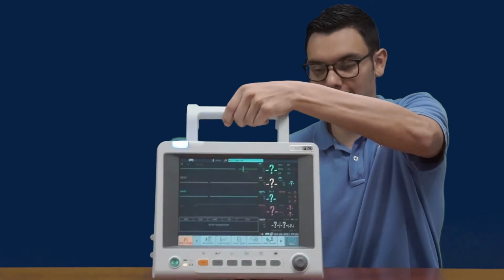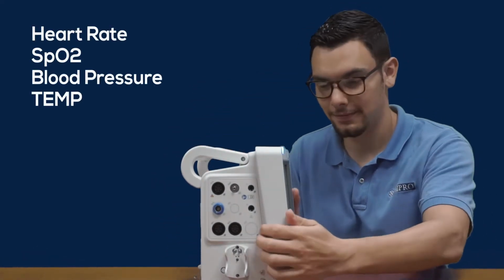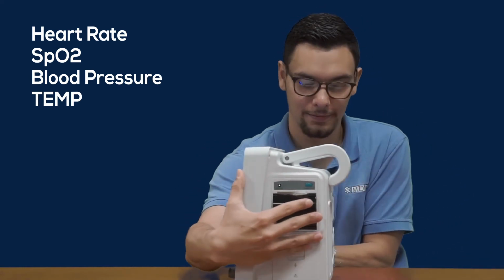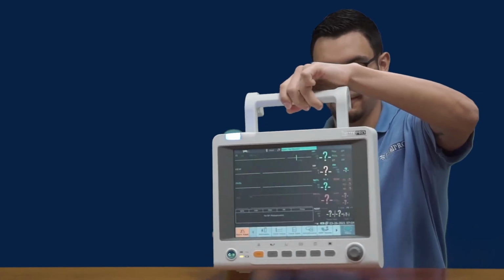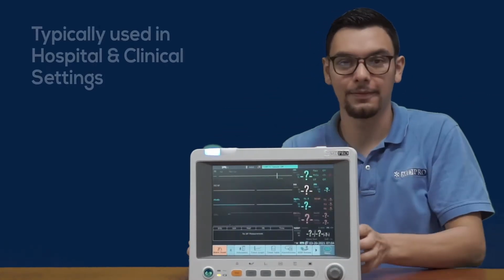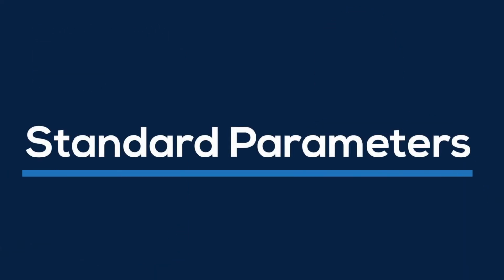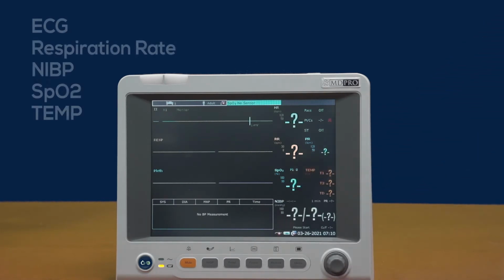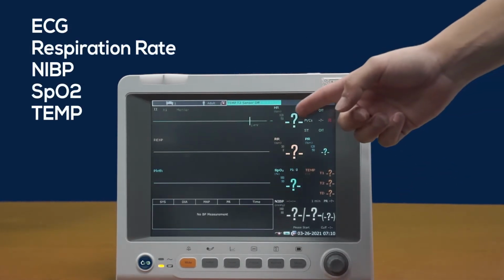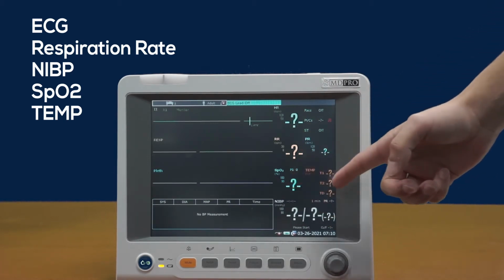Patient monitors measure, record, distribute, and display combinations of biometrical values such as heart rate, SpO2, blood pressure, temperature, and more. High capability, multifunctional monitors are typically used in hospital and clinical settings to ensure a high level of patient quality care. The standard parameters of patient monitors commonly consist of ECG, respiration rate, NIBP, SpO2, and temperature.